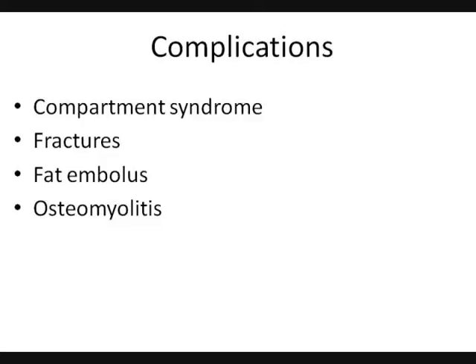A fat embolus. This is a theoretical complication, but it still exists. It's never been produced in a human patient, just animal studies. And the fourth is osteomyelitis, which may occur after the needle has been in place for extended periods of time. The EZ-IO is intended to be removed within 24 hours of insertion. So theoretically, osteomyelitis would probably not be something we see in the pre-hospital setting, but the removal within 24 hours should be mentioned to the staff when you drop the patient off and make sure that they're aware of the length of time that the IO should be in place.